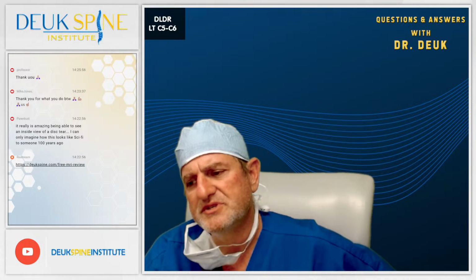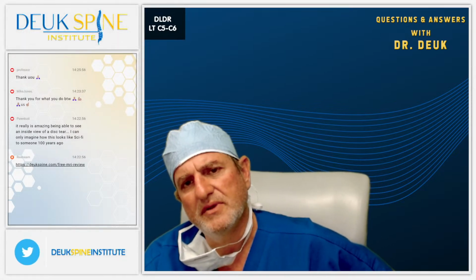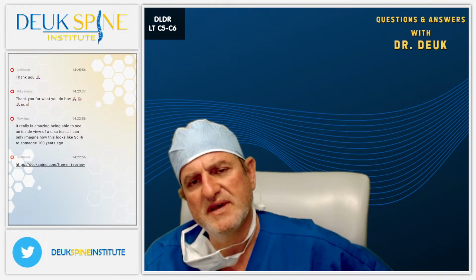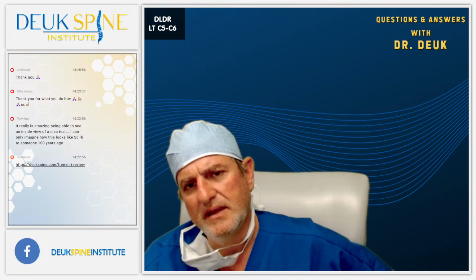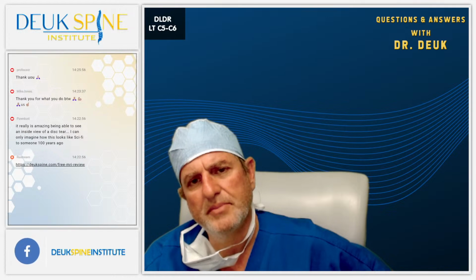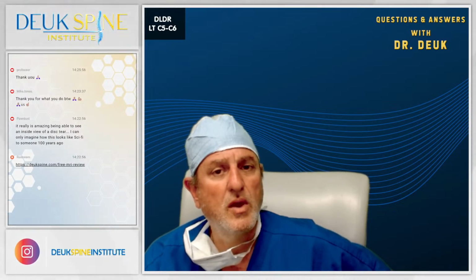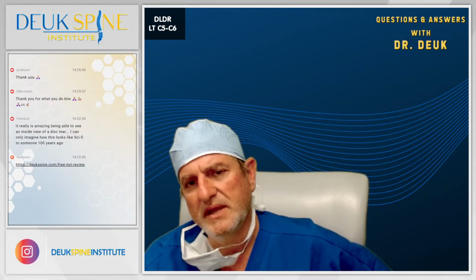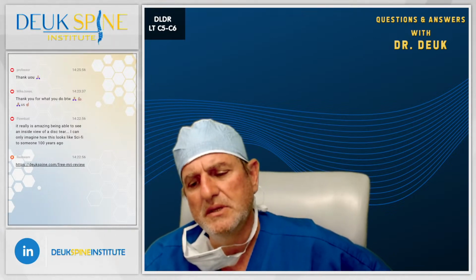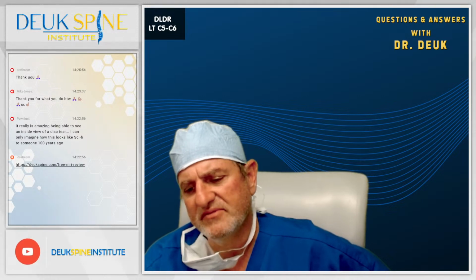So what I do is I pay attention the whole case. I assess constantly throughout the case, what am I doing? Does this have potential for harm? Does this have potential for complication? I evaluate what I'm doing ongoing, constantly, nonstop. Even though I'm talking to you guys and I'm operating, I'm actually thinking, here's an area I've got to be careful. I might hit a blood vessel, might hit a nerve. I need to be right here, right there. It's really just good surgical technique and good anesthesia. And that's why we don't have complications.